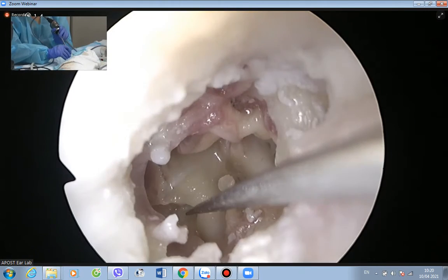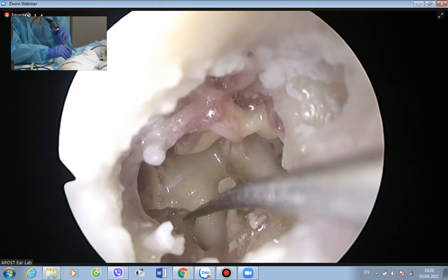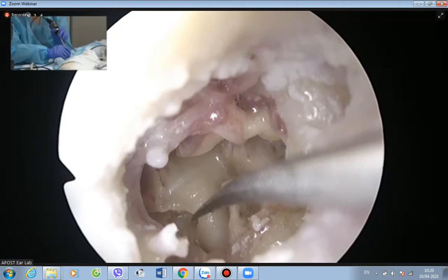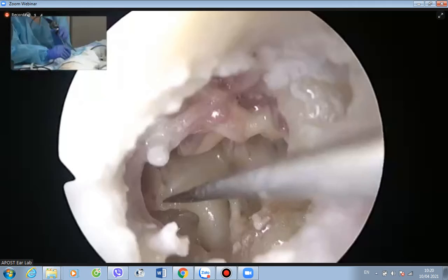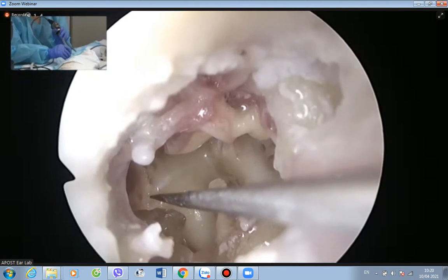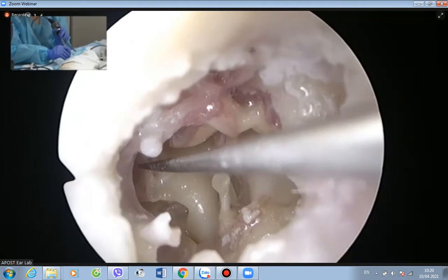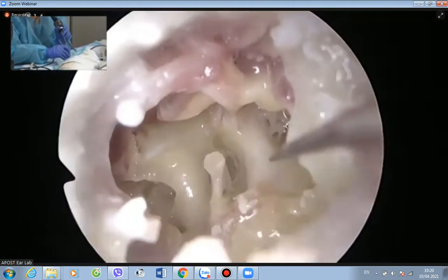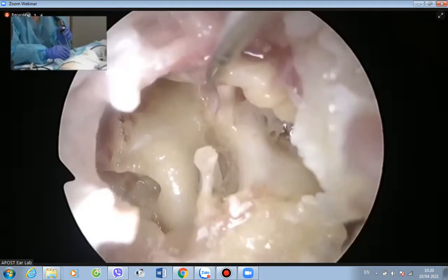Okay, there's a bony niche we call fustus. The fustus is always pointing towards the round window. So this is the round window, and this is the sinus subtympanicus. This is the funiculus, and this is the hypotympanic air cells. So you can see beautifully at a panoramic view of the middle ear.